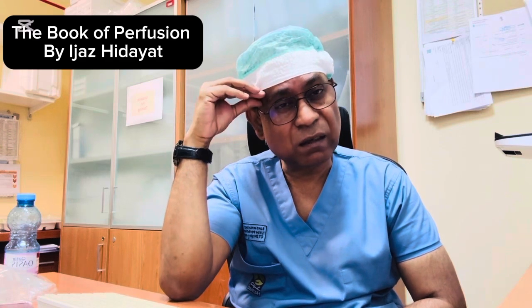So always keep backup venous and arterial cannulas with you. Keep different sizes of your distal perfusion cannulas. Keep your ACT machine with you initially.